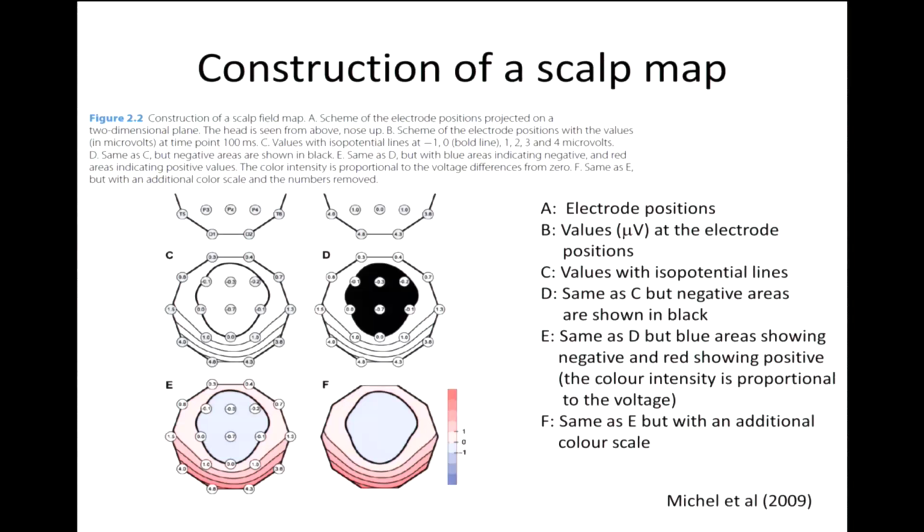So the first, I already showed you these things. The one thing we often use, for any measure, even though we apply it at a single electrode level, is that we want to see how this measure is distributed over the scalp. We showed this in the first lecture; you call it a scalp map.